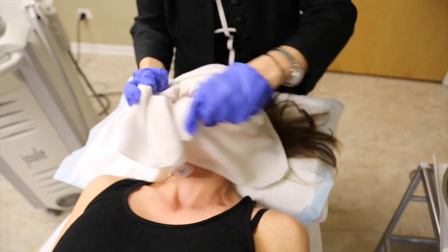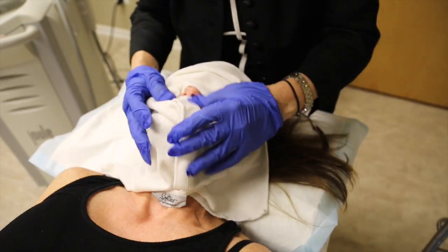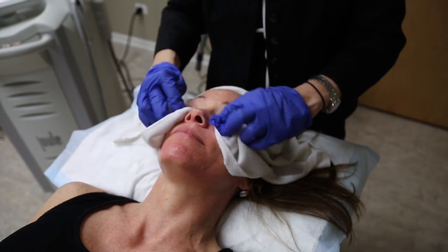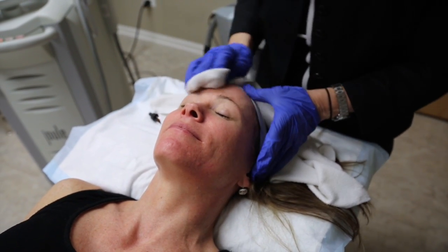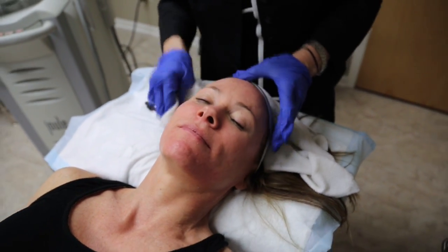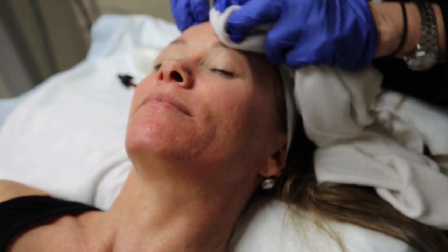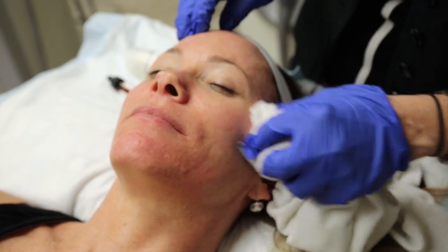So what we do now is we apply a nice cool cloth to the skin. So you can see she's a little pink. She might have a little bit, if you turn your head to the side, a little speckling here that was a little bit of the brown pigment. But she's had a few peels, so there's not a lot of pigmentation left.